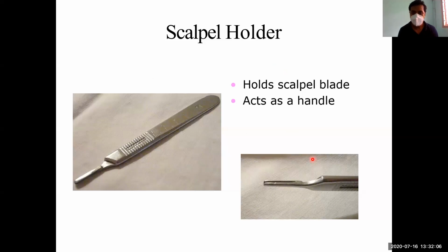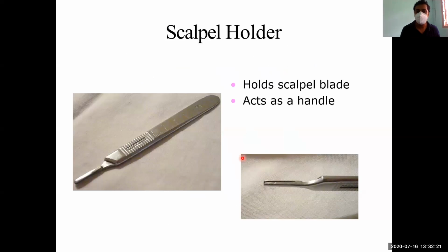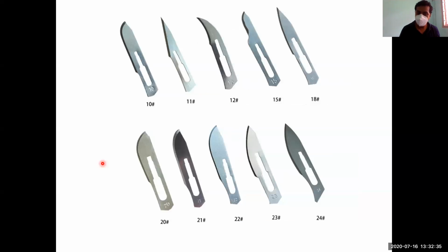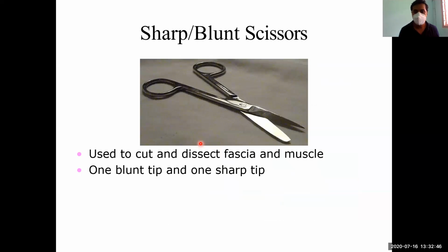Control is very important. So there are generally 4 numbers of this. For the larger one, we will be using handle number 4. The smaller ones will be 3, 5, and 7 number handles. It depends on the tip of the handle, where the blades get attached. Depending upon this tip, the various numbering of the handle has been given. So it is used to hold the blade at this tip part, in any kind of operation we have to do. Okay.